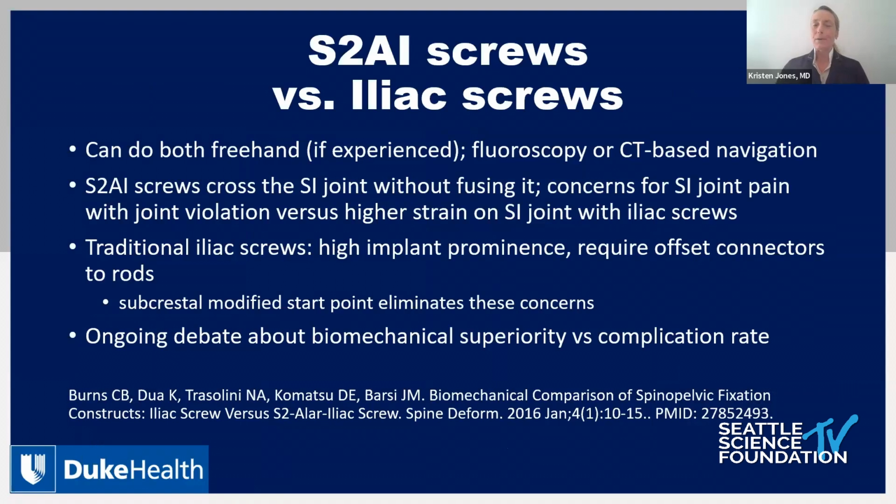And of course, there's always going to be a debate about S2AI versus iliac screws. Is one superior to the other? And probably the truth is they both have their upsides and downsides. And obviously, anymore with the modified iliac trajectories, it's not really a concern for wound healing like it used to be. And many times we don't often require offset connectors even for iliac trajectories.